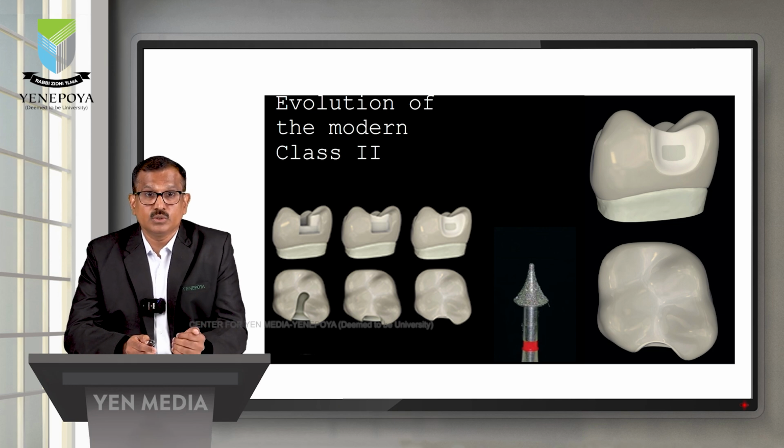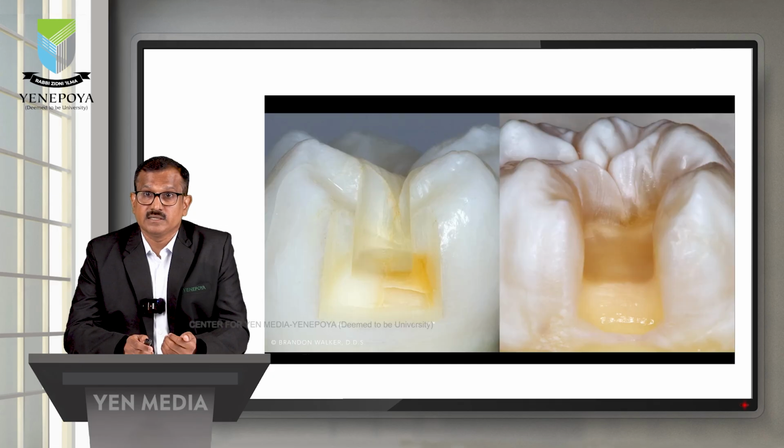So from old to new, remember that we only have to remove caries and make sure that you get a peripheral seal, that is, bonding of the material everywhere, preferably in the enamel, because enamel always gives you the best bonding. Though if it is very deep, the dentine will have to be lined, and a liner has to be placed.